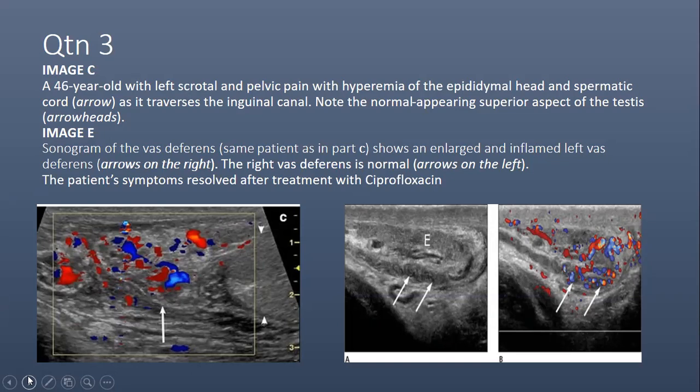I put this case here for a reason, because we have been doing this, and when you look at these images, it's quick to really make a diagnosis, because I failed to get the videos to put them in here. Anyone?